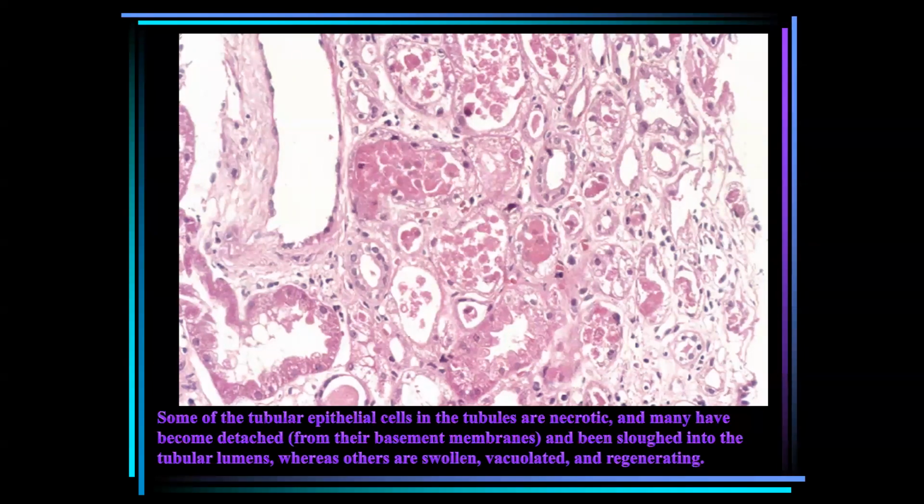and acute tubular necrosis. If you look carefully at some of these epithelial cells like here, you will find this is vacuolated. There is much vacuolation present inside these epithelial cells and here also. And this is a form of injury present in the tubular cells, one of the pathological changes again present in acute tubular injury.